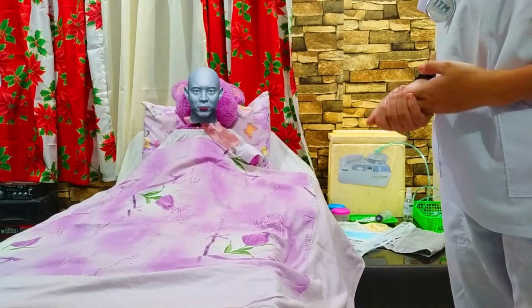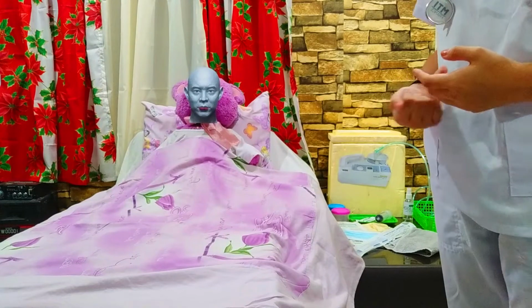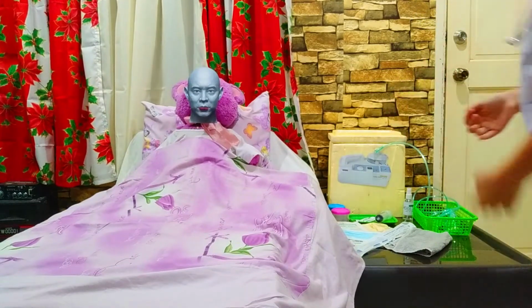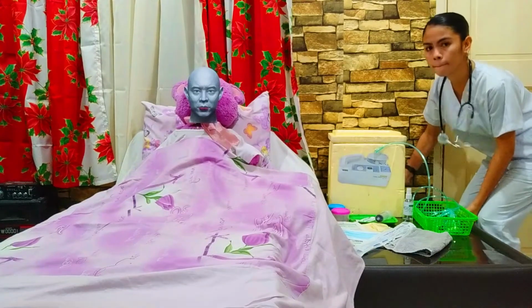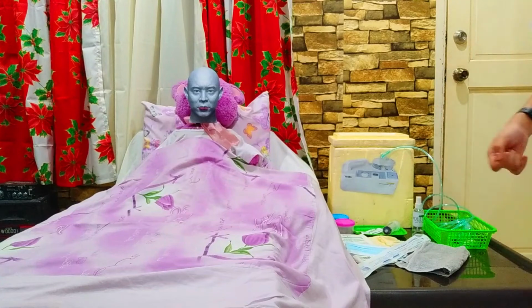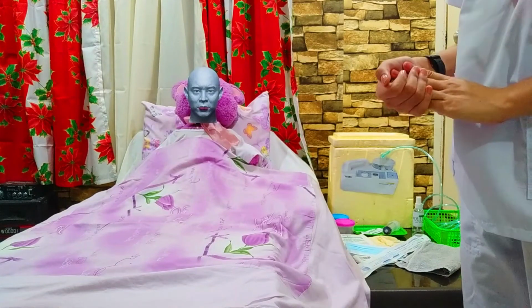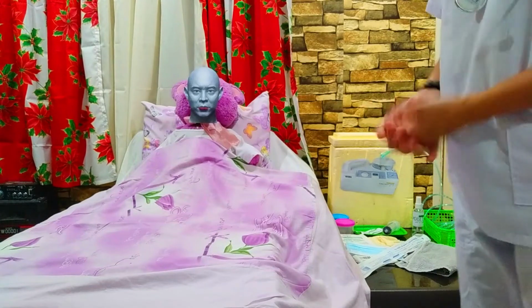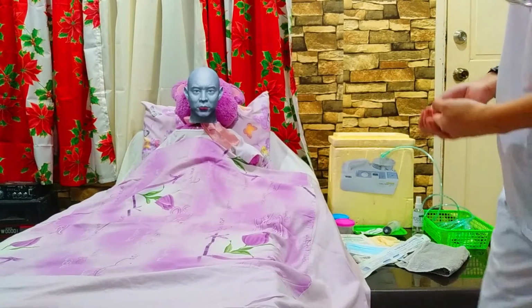The next is we need to move the bedside table close to the working area and raise it to waist height. Then we need to place a towel or waterproof pad across the patient's chest.